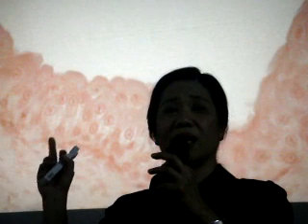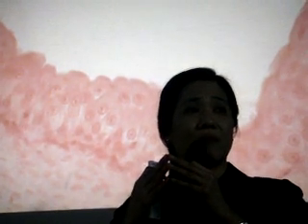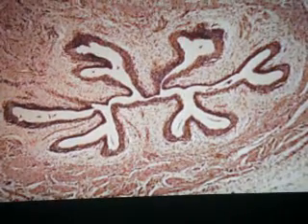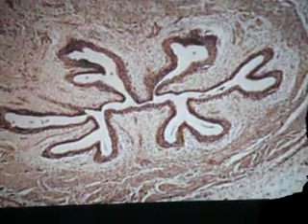So, if the urinary bladder is distended, what do you expect of the cells on the topmost layer? So, napa-flatten. O, kaya expect na it should be a bladder which is not distended ang lalabas sa examination. That's this. Star-shaped lumen, wala na ureter, di ba?